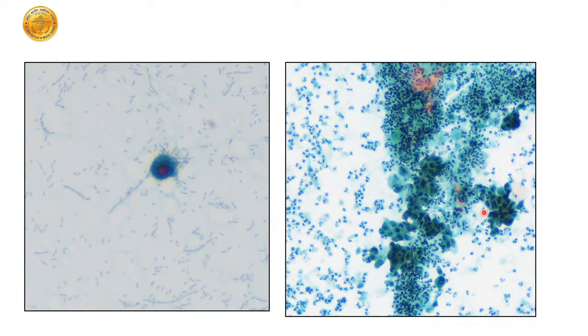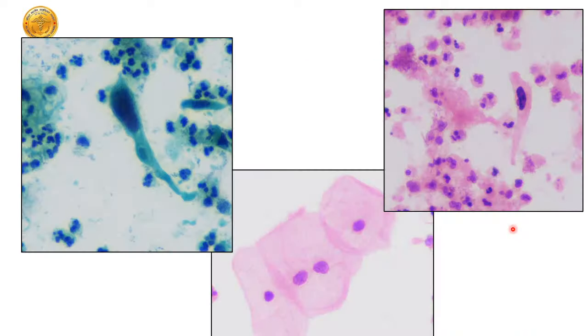Just look at these large clusters. Some of them contain 8 to 10 cells. They are loosely cohesive. They have a high NC ratio. So we call this positive for high-grade urothelial cancer. I'll show you the next slide and let you know why. We had some parakeratosis. Yeah, more images from the same case. Nobody will dispute what this is. Can you type in what you think it is?